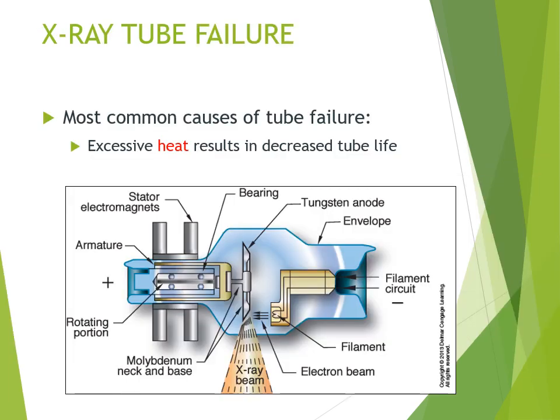X-ray tube failure. The most common cause of X-ray tube failure is excessive heat, and that results in decreased tube life. Now, as far as X-ray tube failure, we can have that as an issue from both the filaments and from the anode.